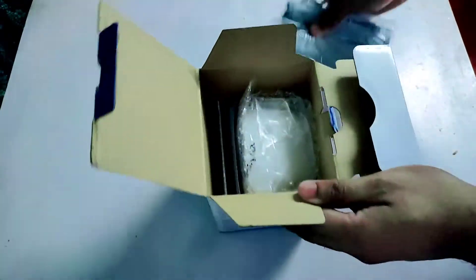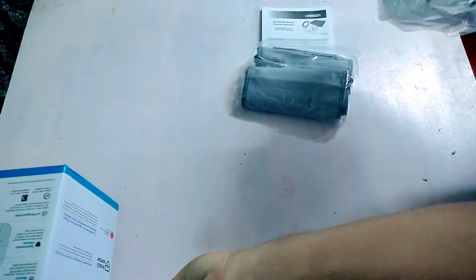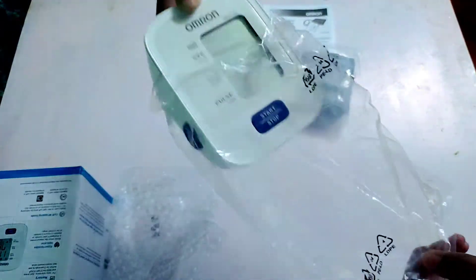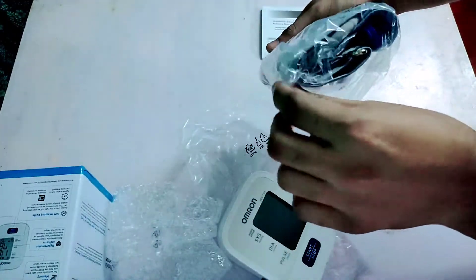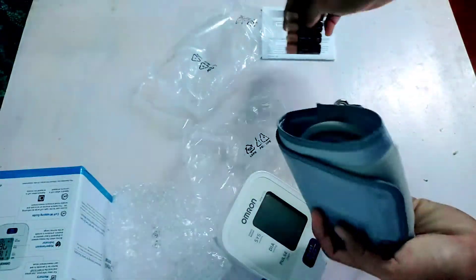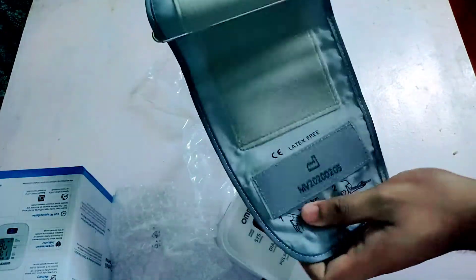Here we have the arm cuff along with four AA sized alkaline batteries, some documentation and the main BP monitor itself. It's nicely packed in a bubble wrap and a plastic fill. It's a latex free arm cuff. Four AA sized alkaline batteries are provided inside the box. This arm cuff is suitable for an arm circumference of 22cm to 32cm.